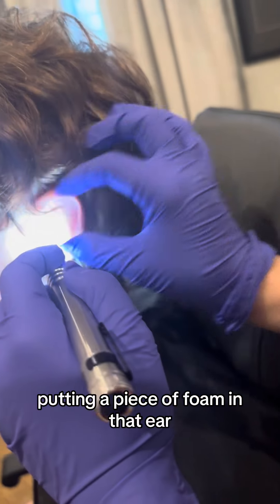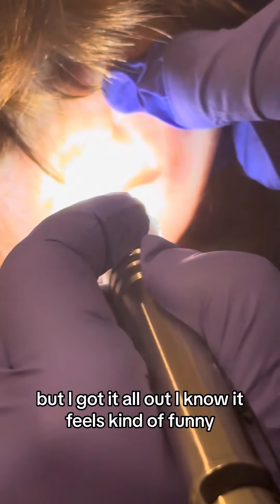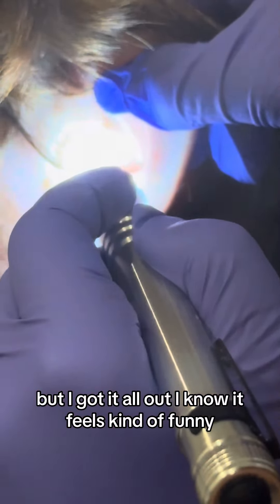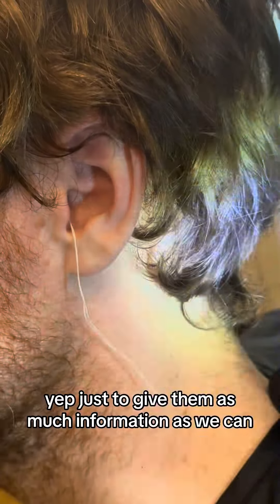Putting a piece of foam in that ear — that's going to protect your eardrum, it'll also absorb any moisture that's left in there, but I got it all out. I know it feels kind of funny. We're going deeper than you would think, just to give them as much information as we can about the inside. Beautiful — ears look great.